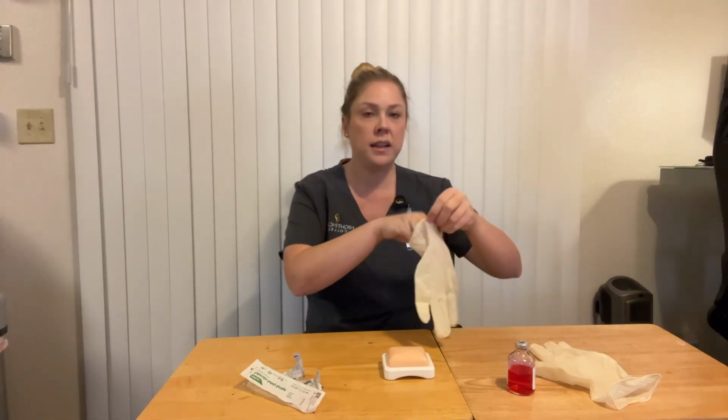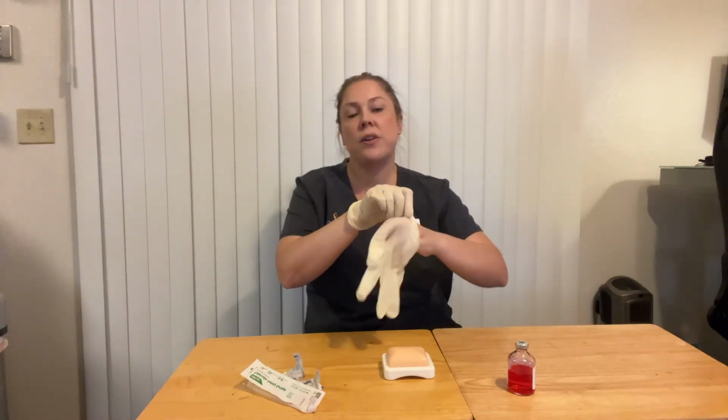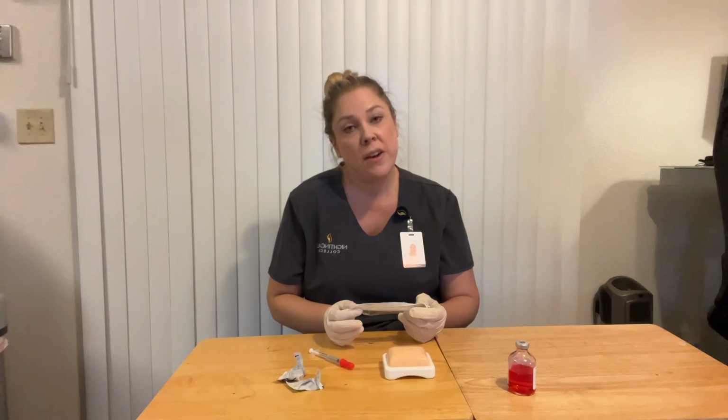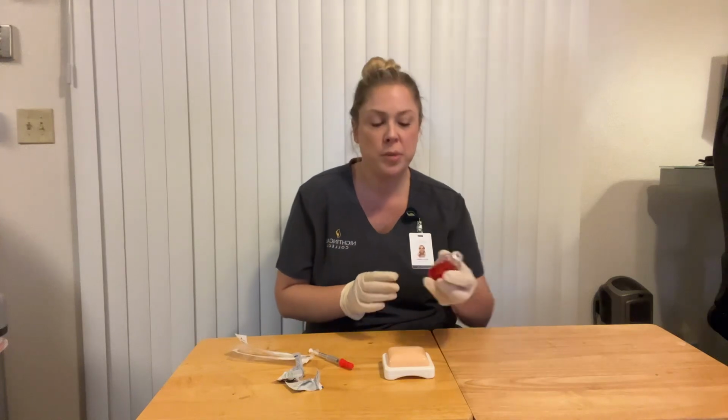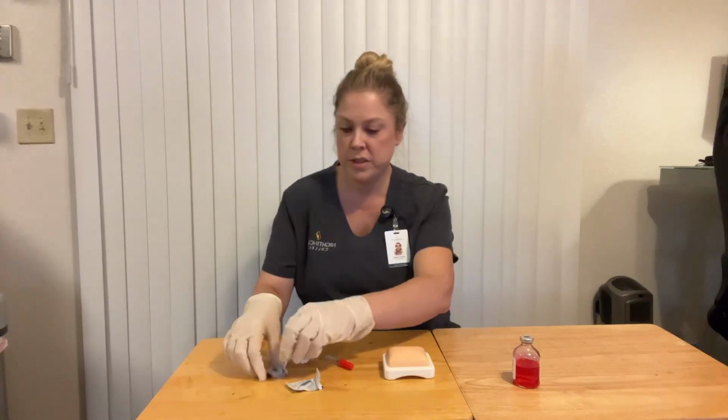Perfect. So I would perform hand hygiene, apply my clean gloves. I would then select the correct gauge and length of the needle for this injection, and also the correct size of the syringe. Today we will be using a tuberculin syringe. It has an attached 25 gauge, 5/8 inch needle. It's a 1.0 mL syringe. I would verify we had the correct tuberculin vial. We'd open up an alcohol wipe and wipe the top of the vial for withdrawing any medication.